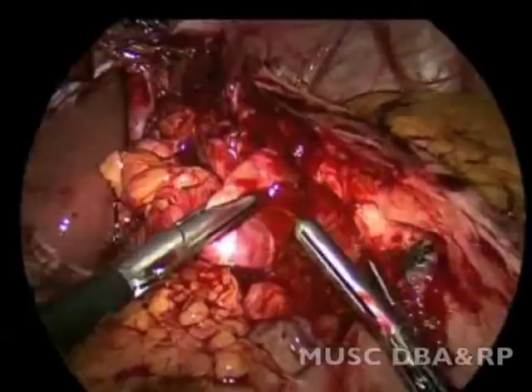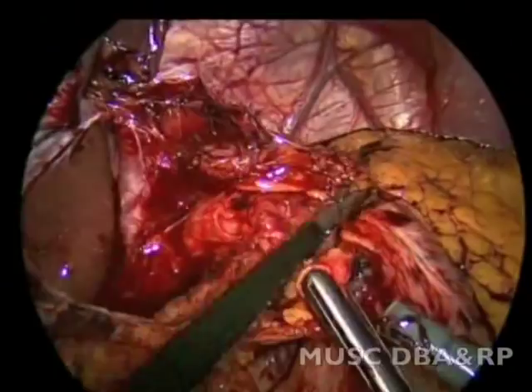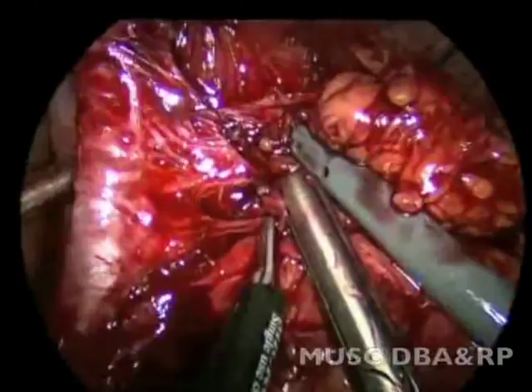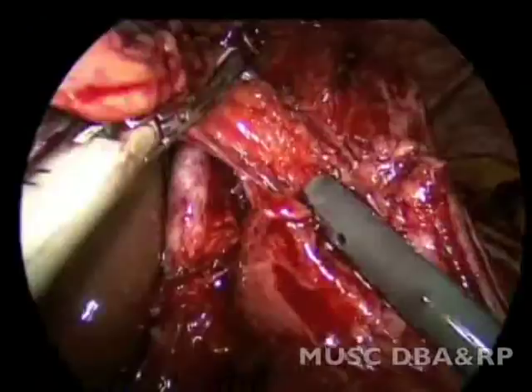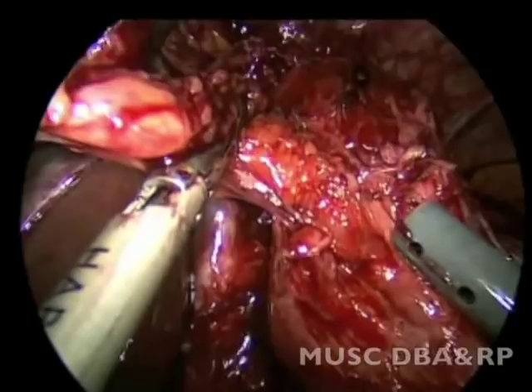Dissection of the wrap off the right crus of the diaphragm was then begun. Greater omentum, which was stuck to the right side of the wrap, was dissected and removed.